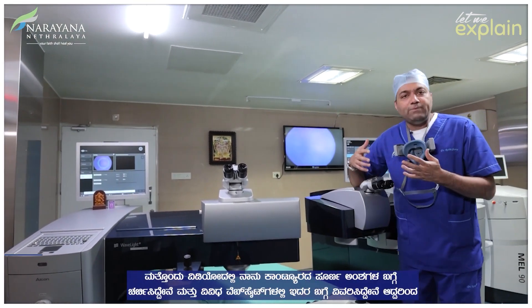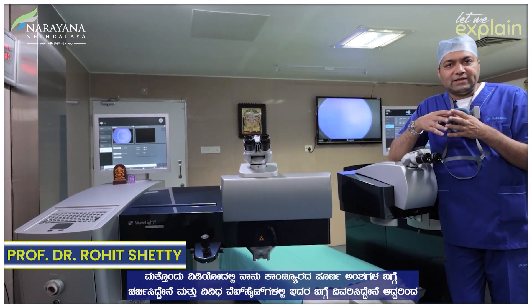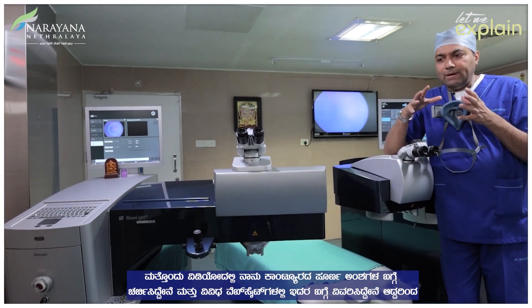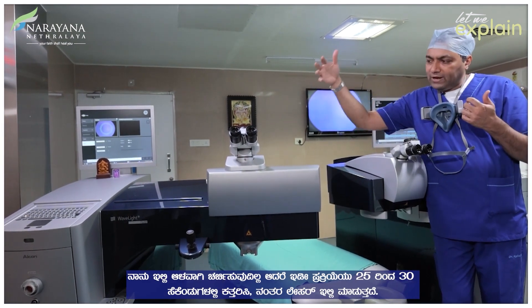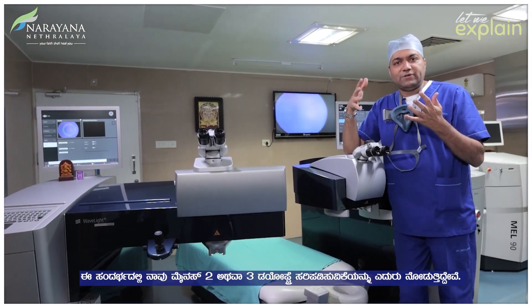In a different video I have discussed the whole aspects of Contura and different websites explain about it, so I'm not going to go into depth here. The entire process takes around 25-30 seconds for doing the cut and doing the laser. In this case we are looking at around minus 2 or 3 diopters correction.